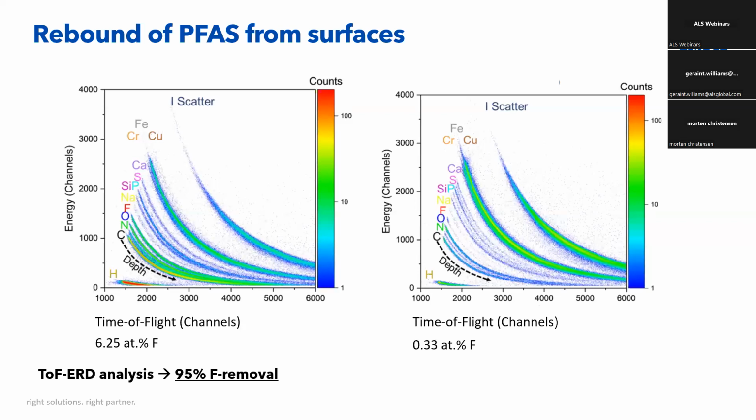As you can see from the graphic here, we've got 2 different graphics. One is the swabbed and one is the unswabbed approach. The difference between the surface elemental composition of the PFAS impacted pipework gives you an indication of the fluorine in the actual sample itself.